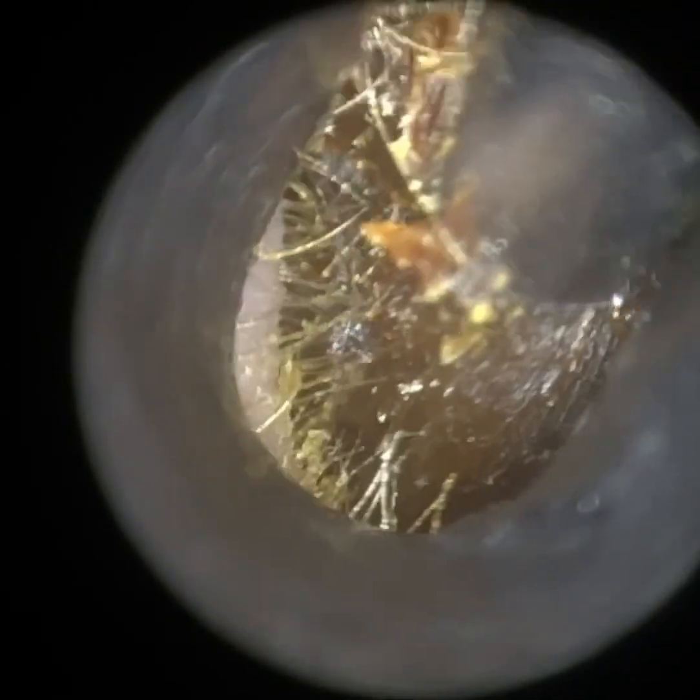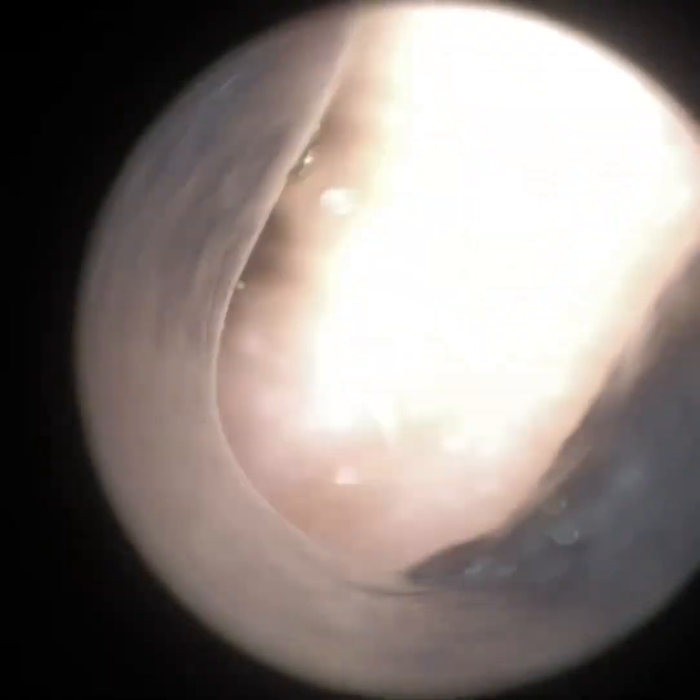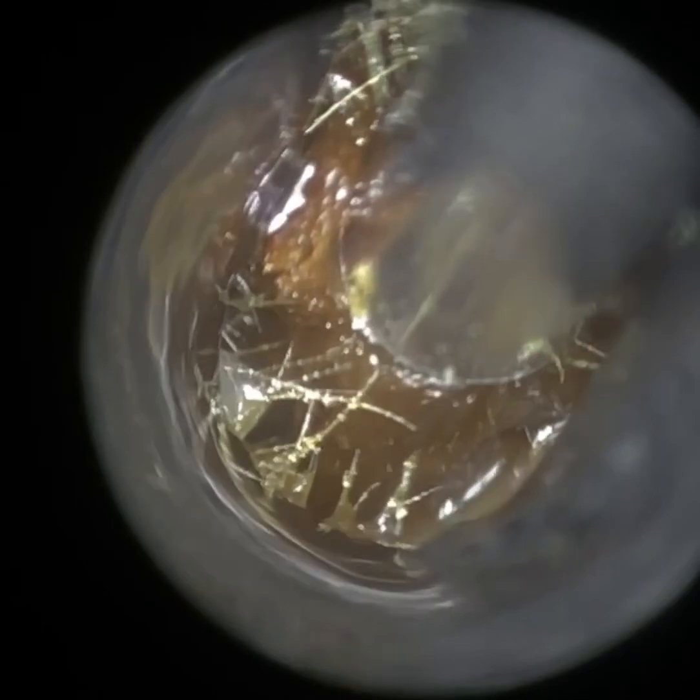I'm just using our smallest speculum here, which is a 3.5mm speculum. With children, I typically use a smaller speculum because obviously children's ears are, on average, a lot smaller and narrower than adults.